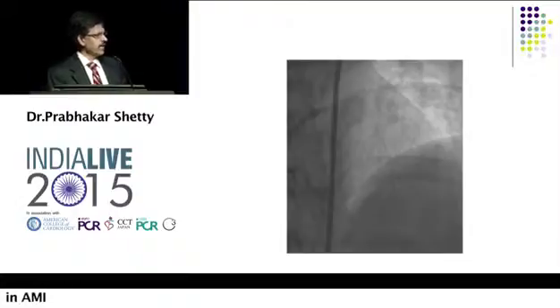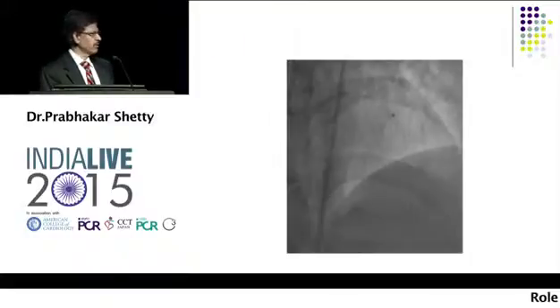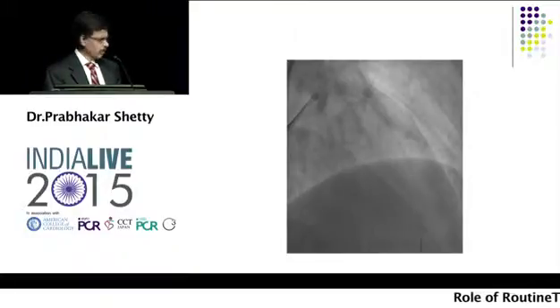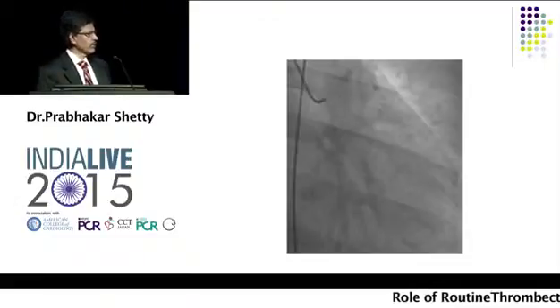This is another young patient, 22 years old, who came with ST elevation anterior wall myocardial infarction, and this is a large left anterior descending artery totally occluded with thrombus. All that we did was just thrombus aspiration. And there's still some residual thrombus. We gave him intracoronary urokinase and also intracoronary abciximab and left him alone. And we rechecked a few days later, it's completely recanalized. So this patient also is doing well about 6 months into the procedure.